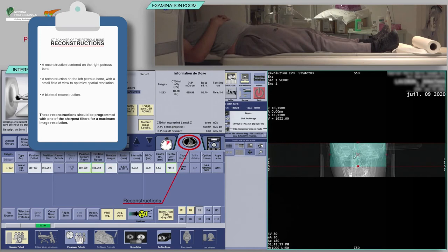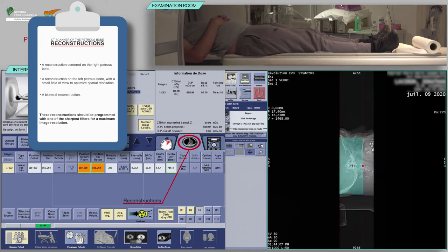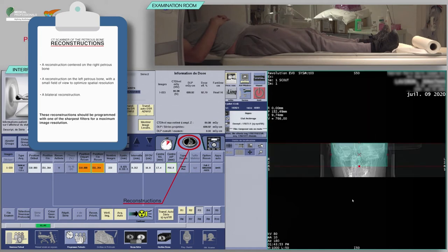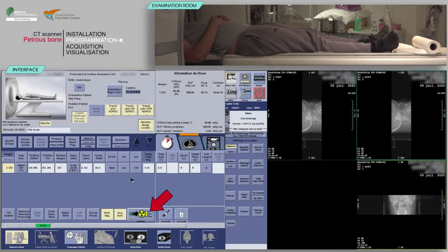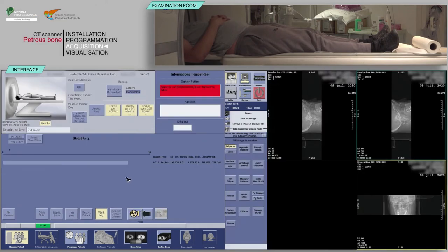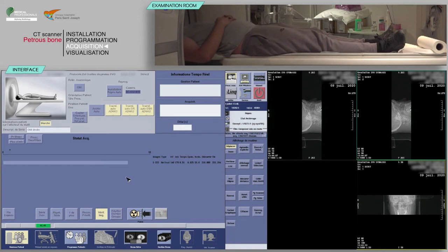These reconstructions should be programmed with one of the sharpest filters for maximum image resolution. Click on confirm. On the keyboard, move the table and proceed with the acquisition when the buttons flash.